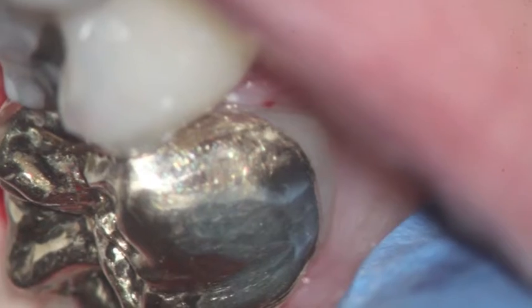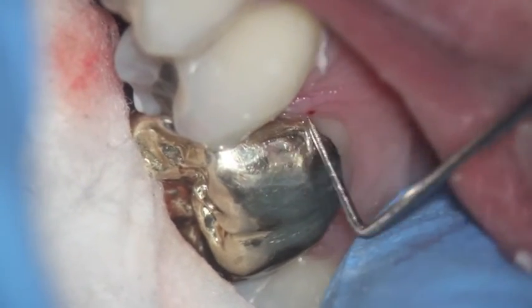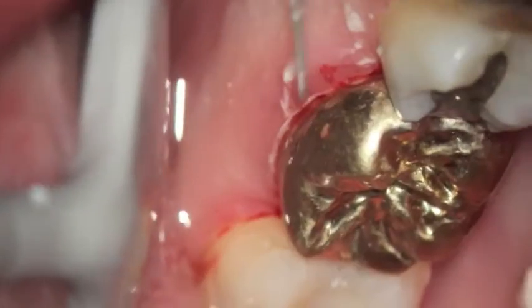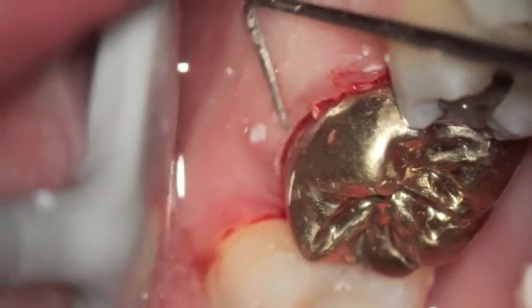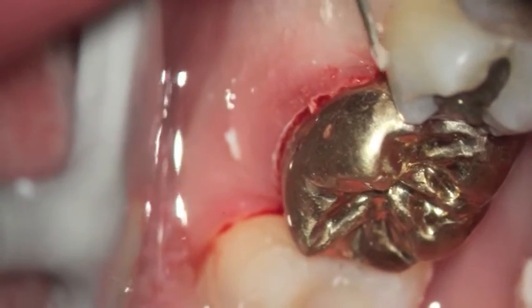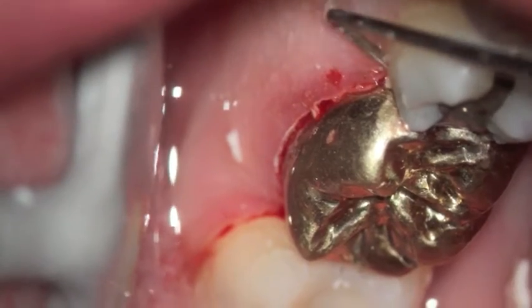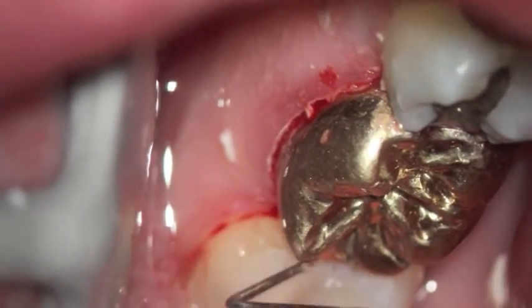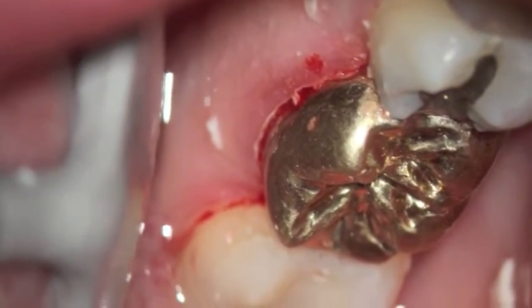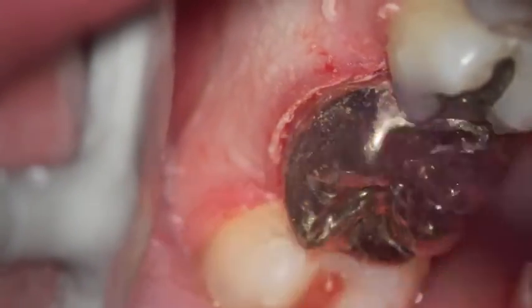I'm checking the gold crown where the fit between the crown and the tooth is so that it's nice and smooth and that I can't get an explorer or any instrument up underneath it. And I'm looking to see that it's a nice smooth fit in every place that I can possibly get my instrument. And that's one of the benefits of a gold crown, is the fit.